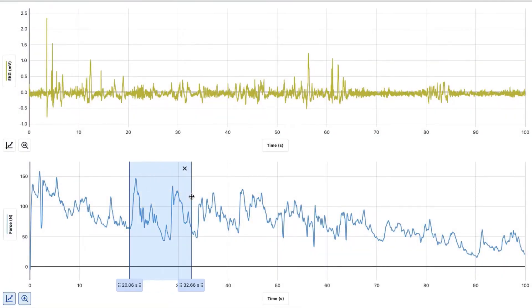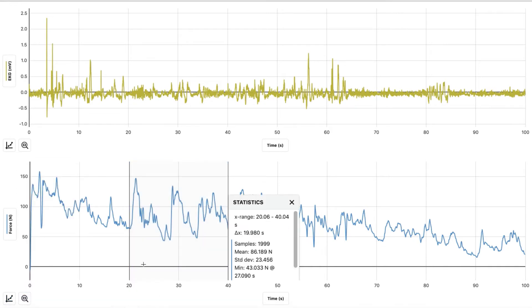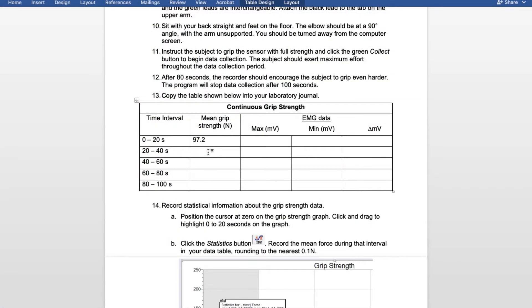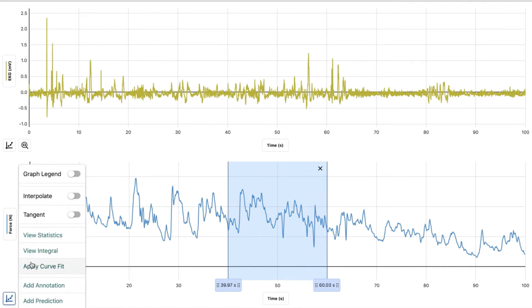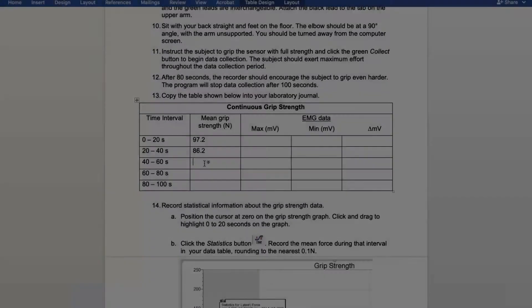Next, select from 20 to 40 seconds. Hit the graph, view statistics, and it'll give you the mean. For 20 to 40, we got 86.2. Then select 40 to 60. Hit the graph, view statistics, and it will give you the mean. For 40 through 60, we got 86.0.